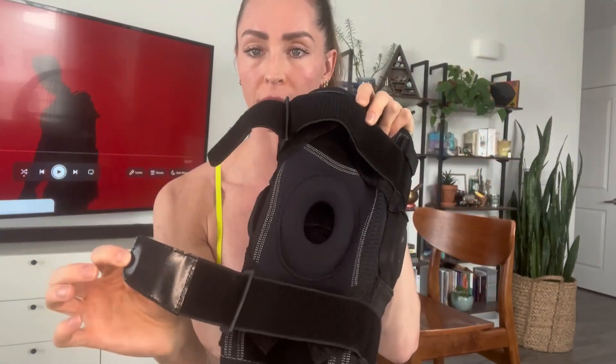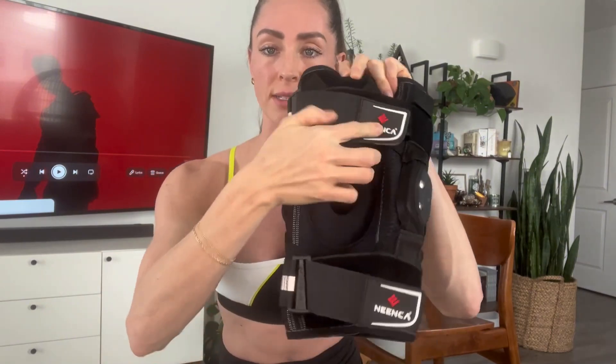It's very good quality, very supportive. It has two straps that are Velcro on the top and bottom that you can adjust to the sizing that you need around your leg. It's a little bit difficult to see here, but it has a nice padding and opening where your kneecap goes.